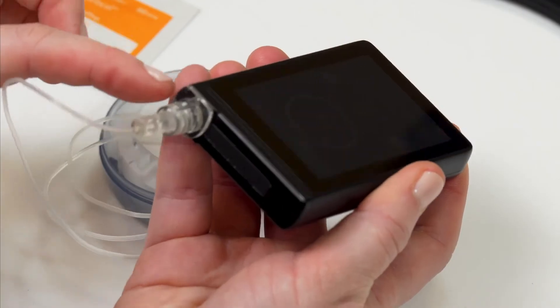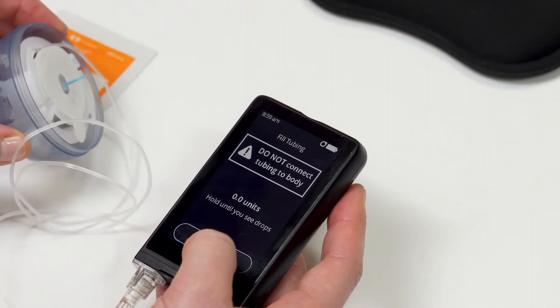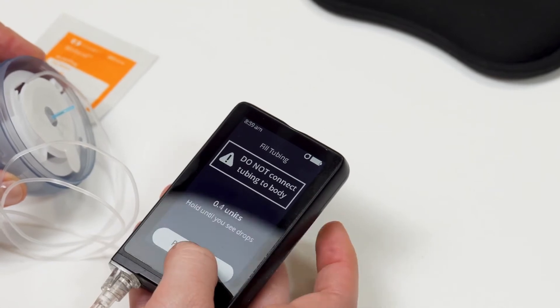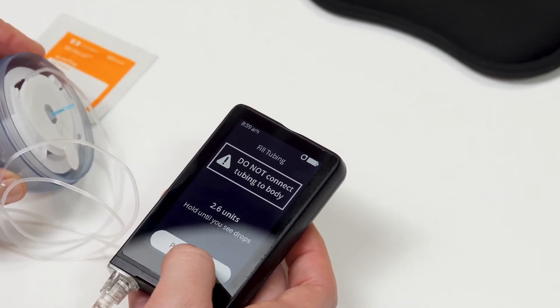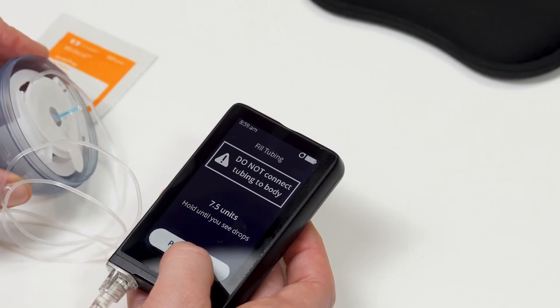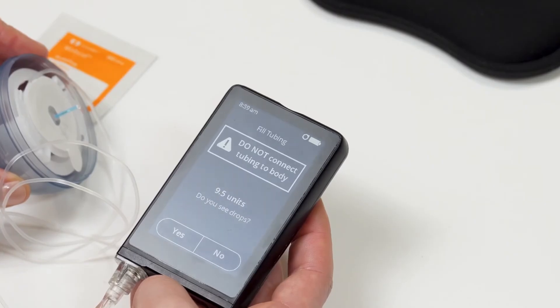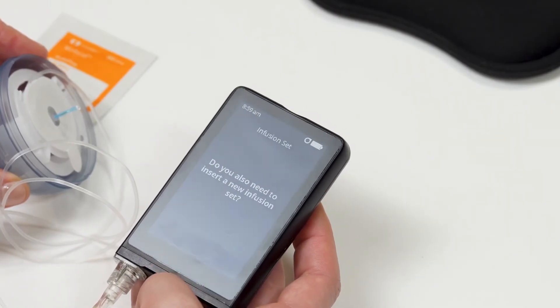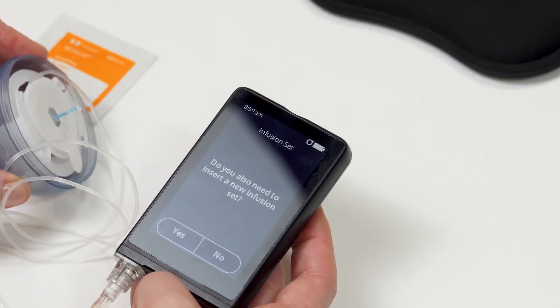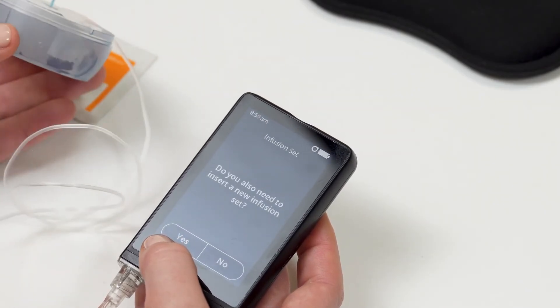When the islet connect is installed, tap go to fill tubing. Your infusion set and tubing should not be attached to your body. Hold the press and hold button until you see drops of insulin appear at the end of the tubing. Tap yes if you see drops at the end of the tubing. Tapping no will take you back to the press and hold screen so you can continue filling the tubing with insulin until you see drops.